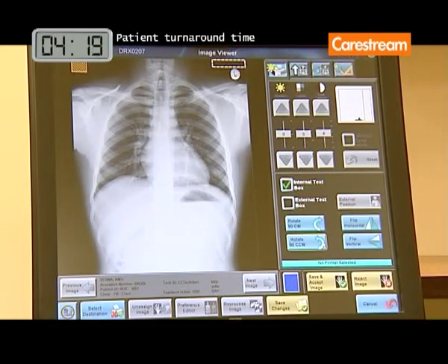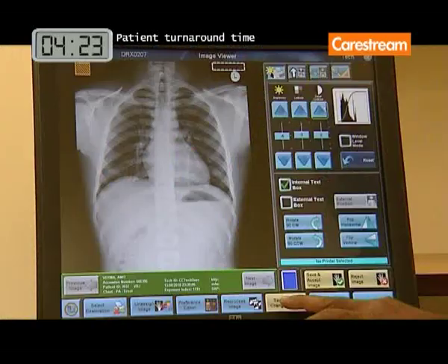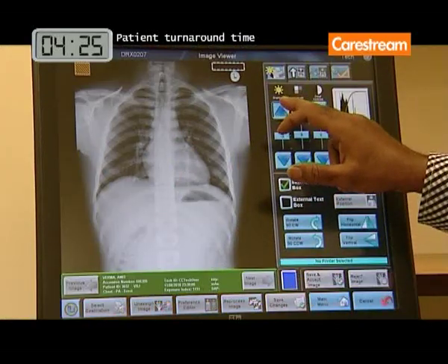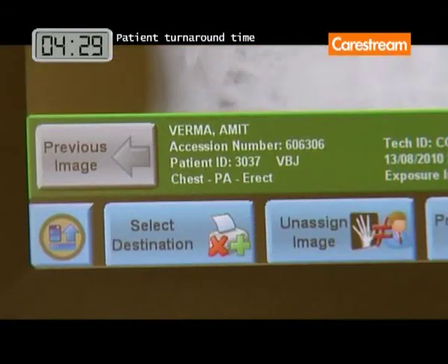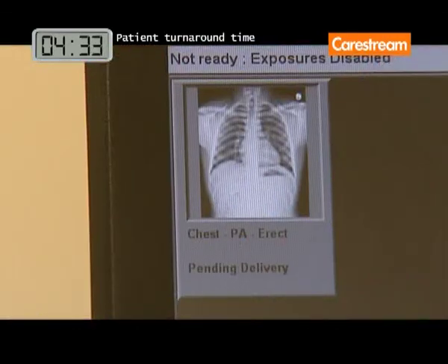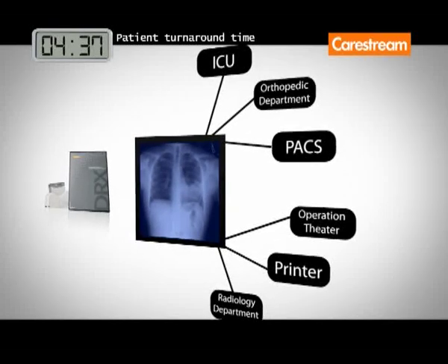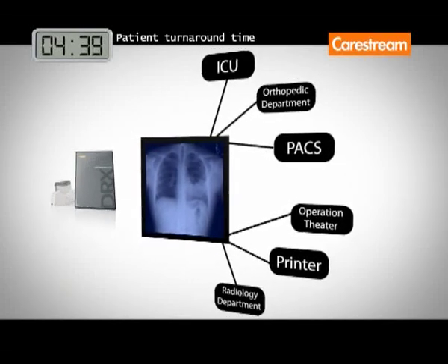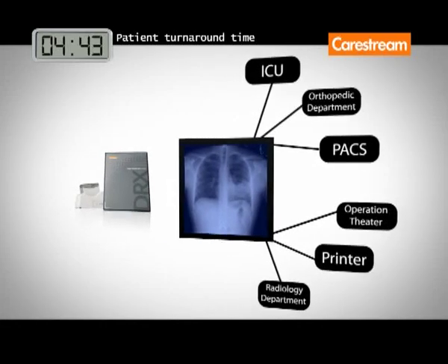After exposure, the X-ray cassette wirelessly transmits digital images to the system's capture console for immediate viewing and manipulation. From the console, images can now be quickly forwarded to a printer, PACS, or sent through the network to various departments across your hospital or medical centre.